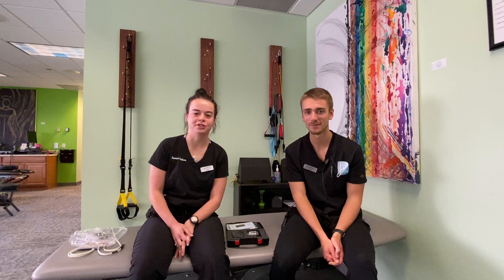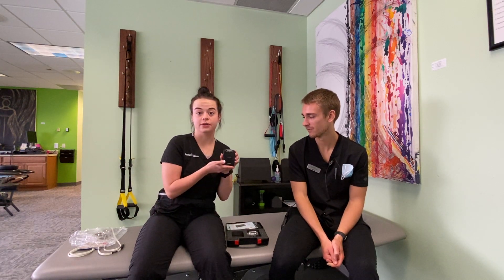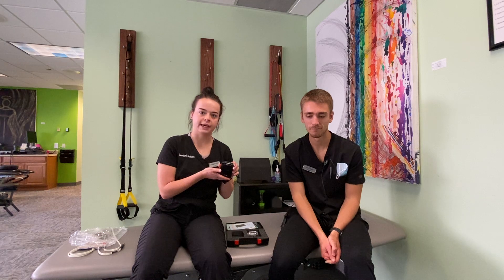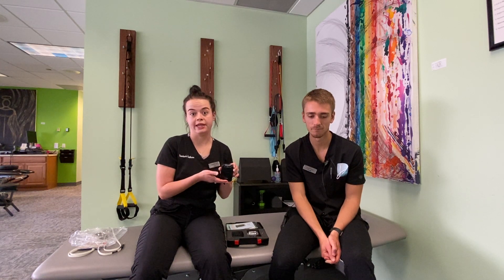Hi, my name is Libby and I'm Jacob, and we are rehabilitation technicians here at Town Towns Healthcare. Today we're going to go over the TENS unit. The TENS unit is a portable electrical stimulation or e-STIM unit. What e-STIM does is it fatigues muscles that are spasming, brings endorphins into the area, and acts as acute pain relief.